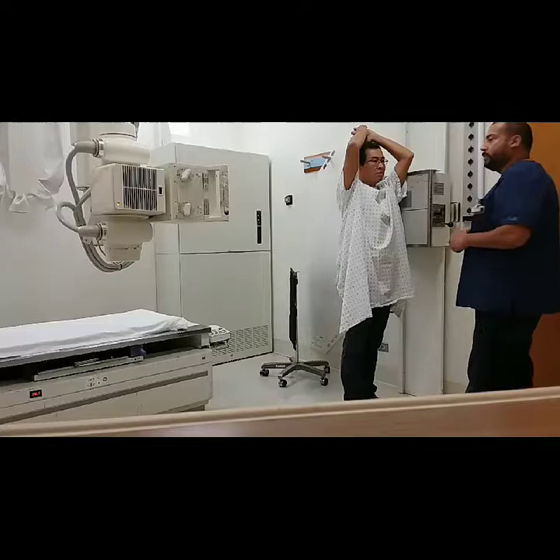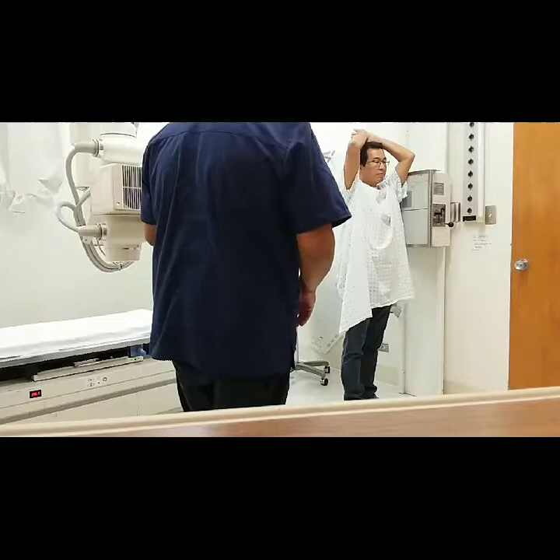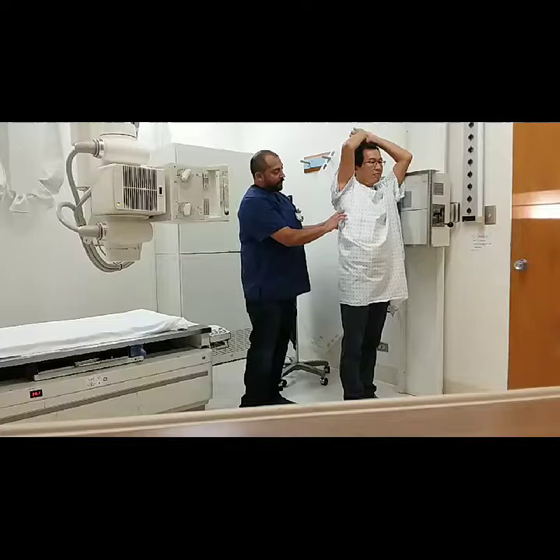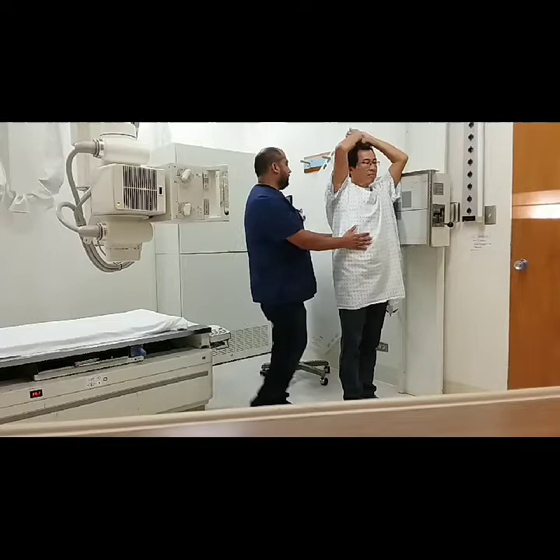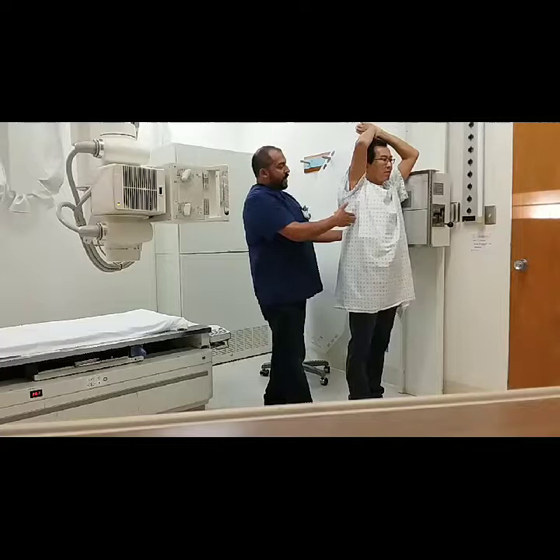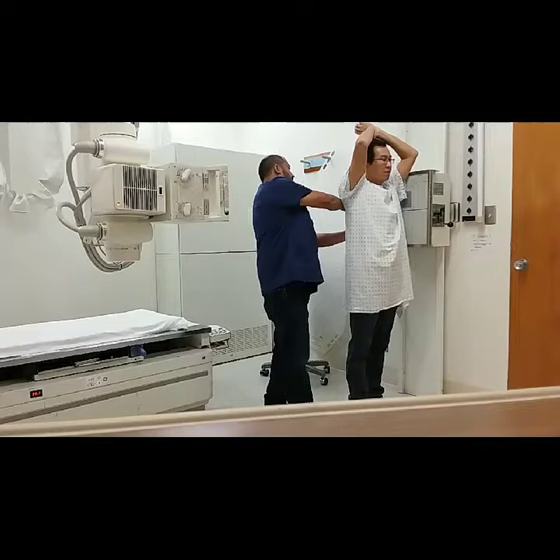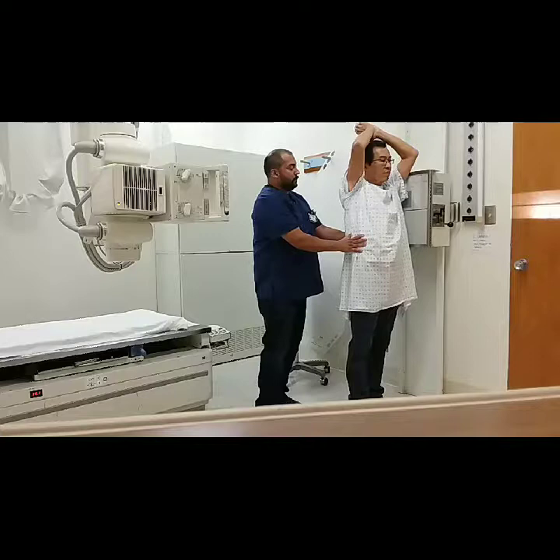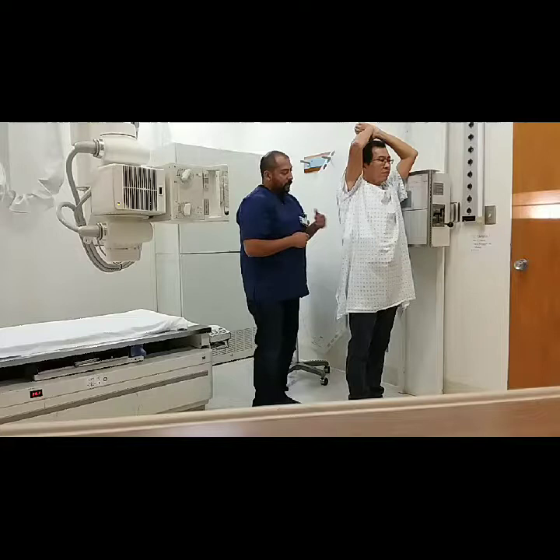For an elderly patient who needs a little help, we have an assistant here. We want to reposition our patient so our center beam comes to mid-coronal, inferior to the inferior angle of the scapula. You can palpate for the scapula. I'll have him take a step forward so the IR is centered mid-coronal — you can reference the patient's ear to check centering. We want a little bit of light showing behind the patient, then slightly rotate so the posterior ribs are superimposed on each other.